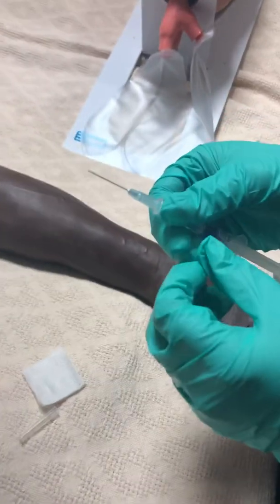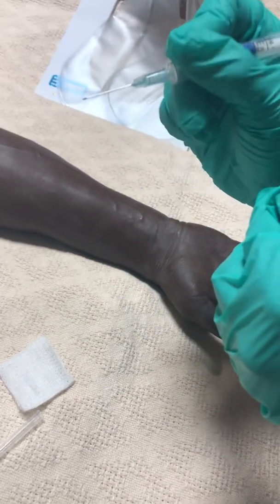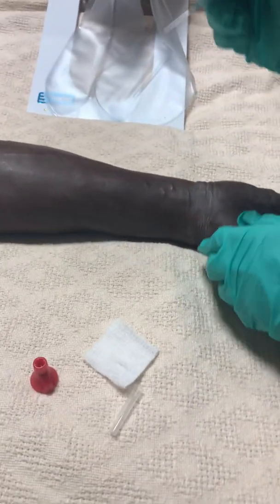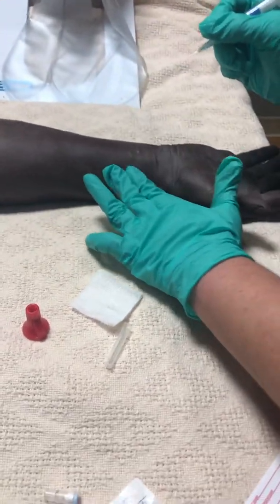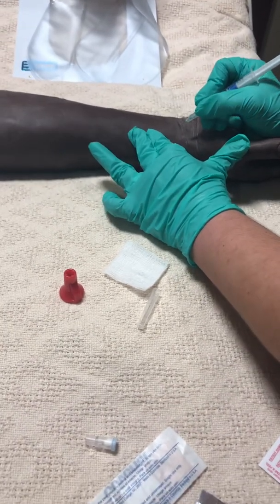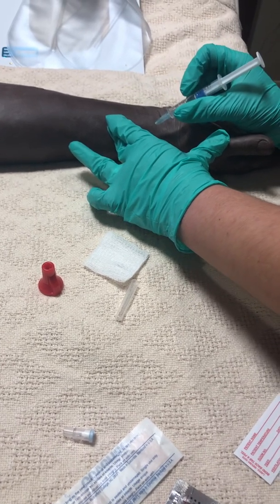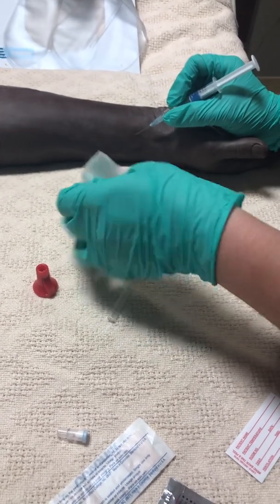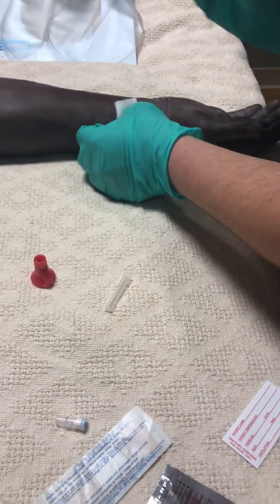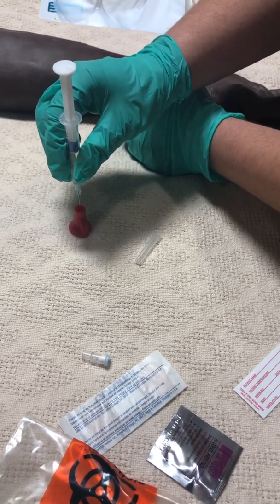I always need to make sure I have my bevel up. That is the way I need to go in, because I don't want to puncture something else and hurt anything inside. I hold it at a 45-degree angle, like you're holding a pencil. I palpate the radial artery again, and when I'm ready, I remove my finger like that. Then I should start to see blood flow into the tubing. I don't want to move the needle around. When I'm ready, I put gauze there. When I'm done, I push the needle into the stopper so it curls the needle, and then I dispose of the needle in a sharps container.